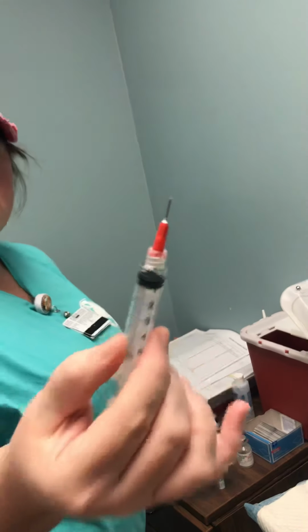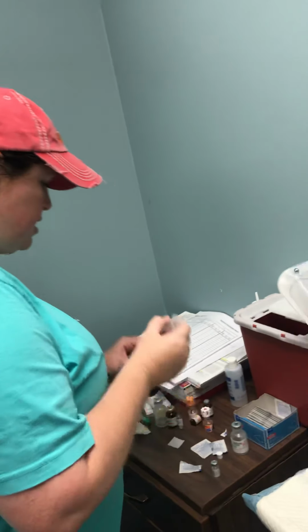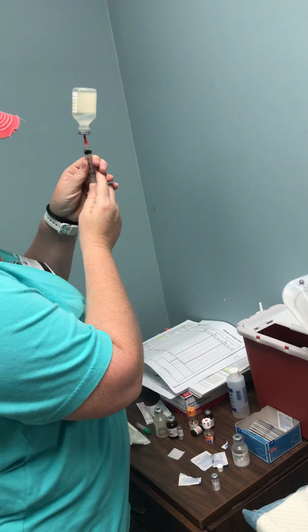Okay, I have 0.6 of morphine. And then I'm going to draw up the rest to dilute our medicine.